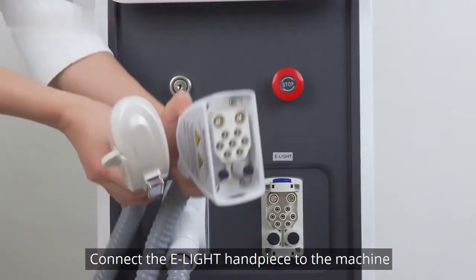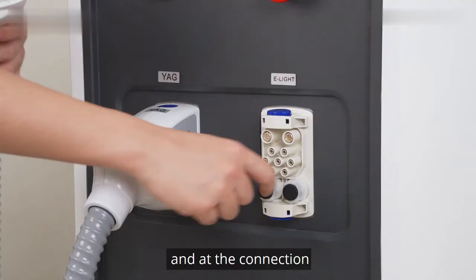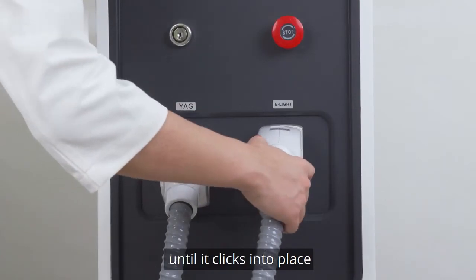Connect the E-LIGHT handpiece to the machine. Remove the black rubber caps on the connector and at the connection. Insert the connector aligned with the small holes and push the connection until it clicks into place.